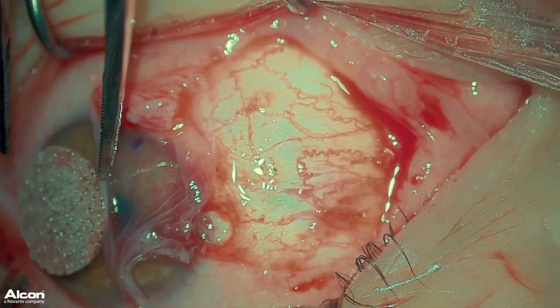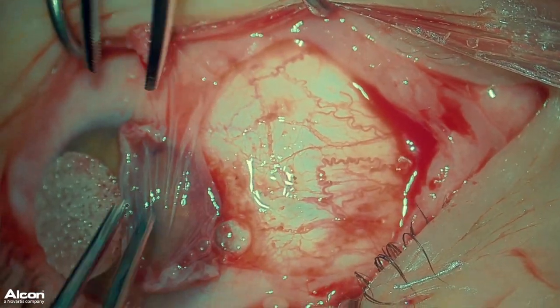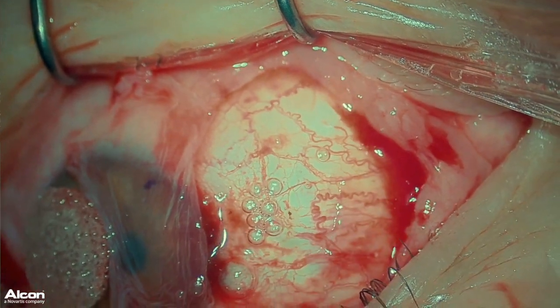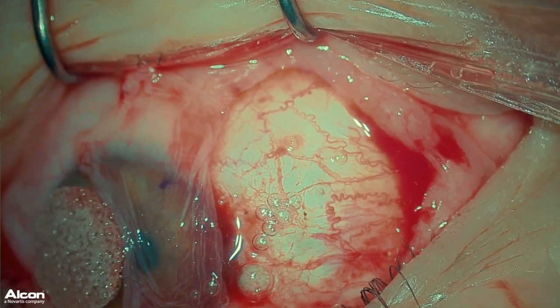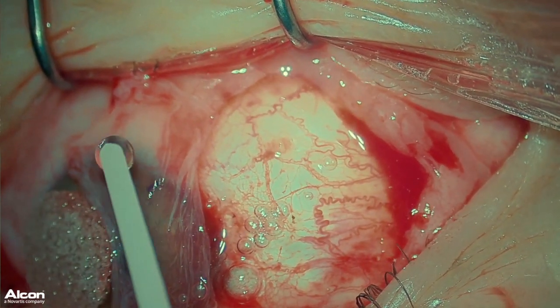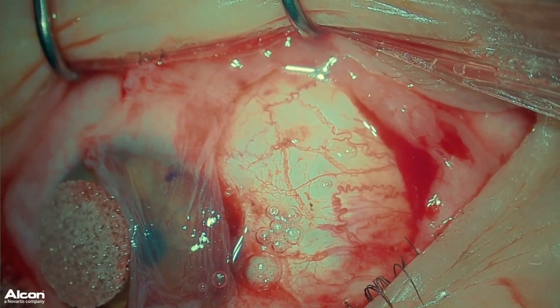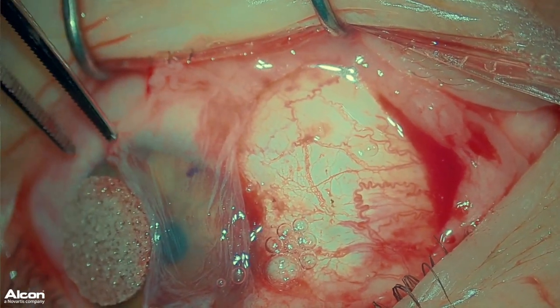Using two non-toothed forceps, I reflect the graft back over the cornea. I then apply the components of the fibrin glue — one component to the bare sclera, and then the second to the graft. Then using the same non-toothed forceps, I reflect the graft back over the area of bare sclera.